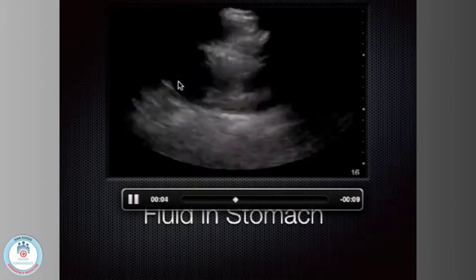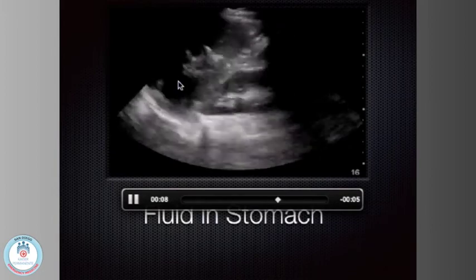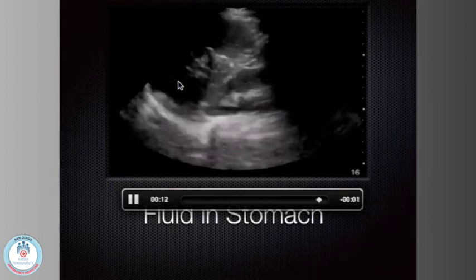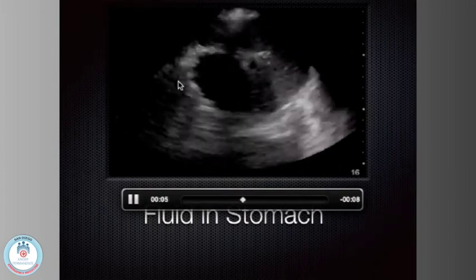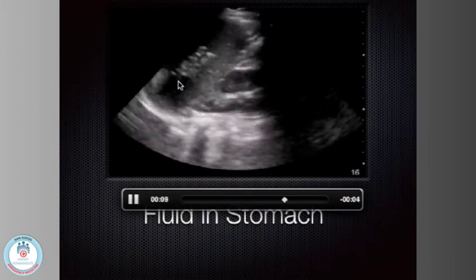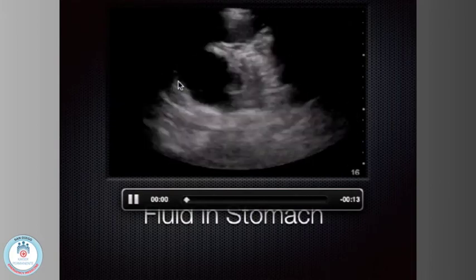And we saw that fluid there. She went to the operating room for a laparotomy. Pre-op diagnosis, hemoperitoneum; post-op diagnosis, presence of gastric fluid. So it's one of those embarrassing moments where we had to explain everything to everybody and show them. Our surgeons saw this and got very excited. A surgeon sees black stuff on a FAST exam, they start sharpening their scalpels.